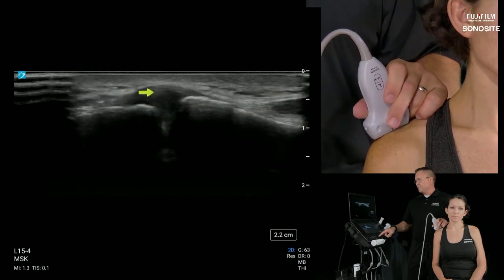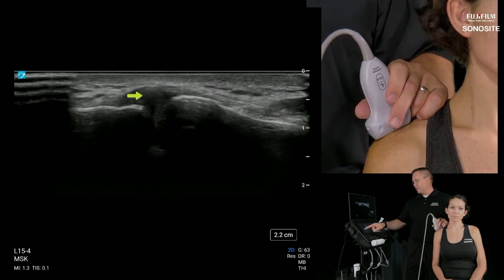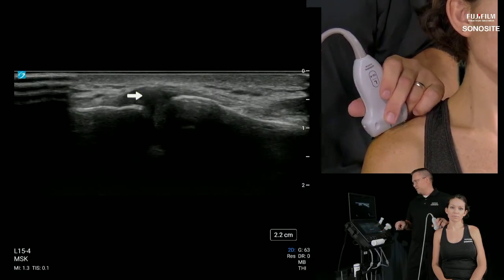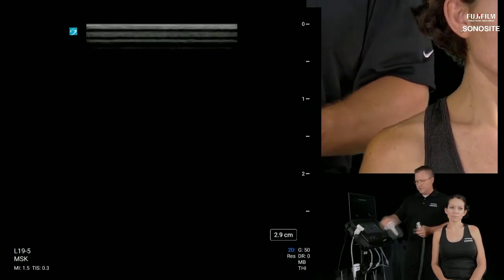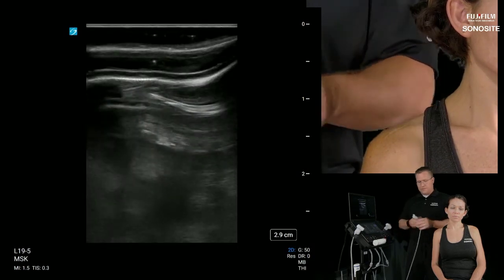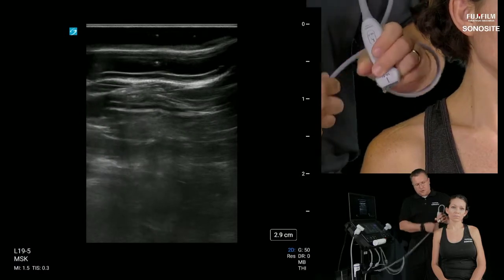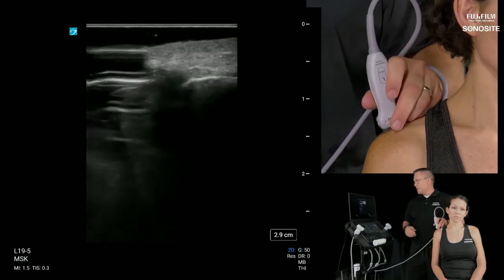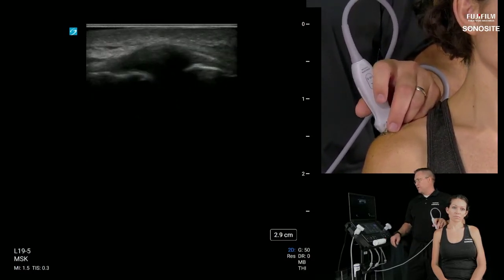Let's take a closer look at this ligament here, the AC ligament, by switching over to the 19 megahertz linear, which is a smaller footprint. It's going to be a little bit more zoomed in. So this transducer begins zoomed out for perspective. That way we don't get overwhelmed with what we're seeing in the shot, overly zoomed in. There we go. And then we will slowly creep our depth up so that we can appreciate all these little fibers.